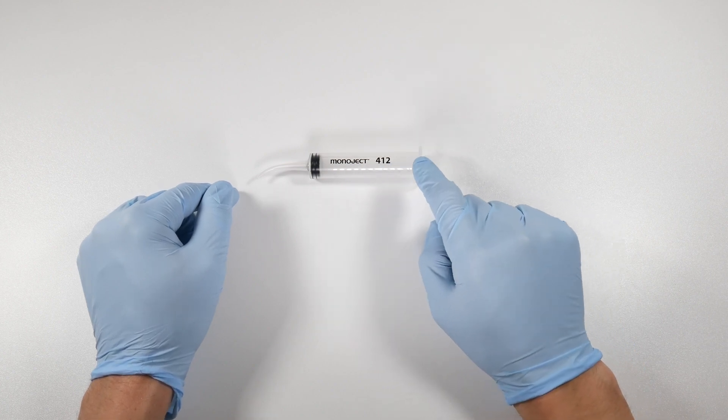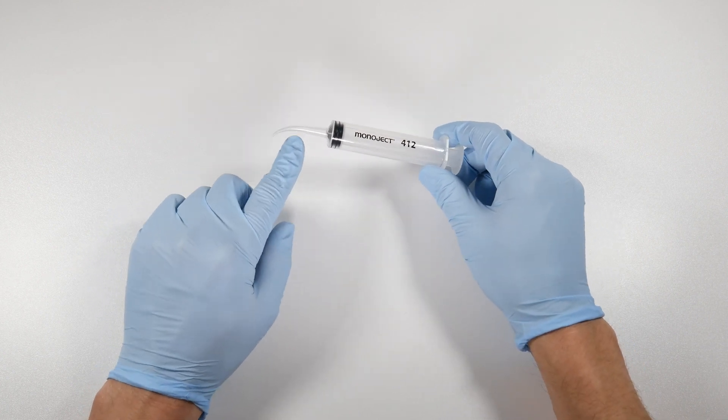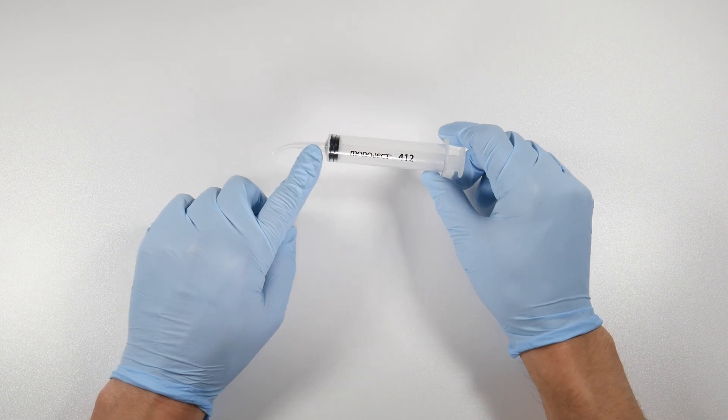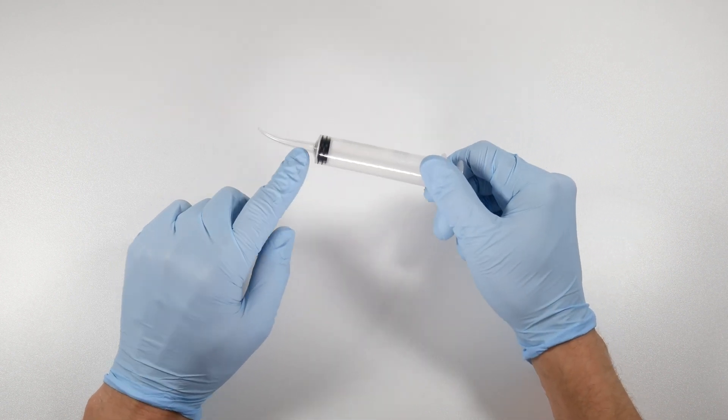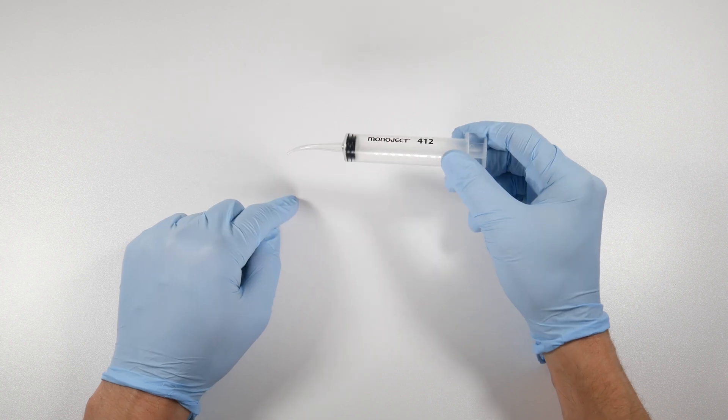The Monoject 412 is basically a syringe with a really narrow little tip on it. It has a curve to the tip which allows you to get better access to the upper teeth or the lower teeth when you're irrigating.